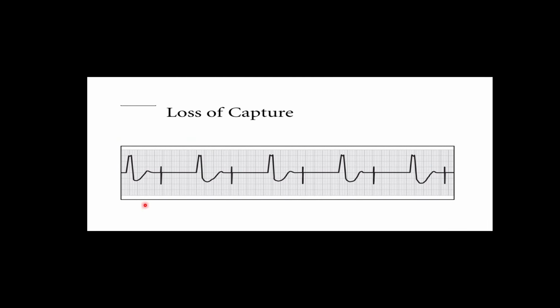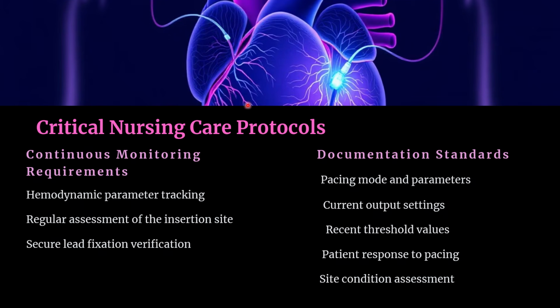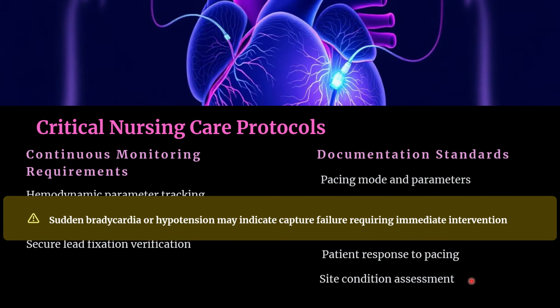Here there is a spike not followed by a QRS complex. That means there is no capture. Next is the clinical nursing care protocol. Continuous monitoring is required; hemodynamic parameter tracking is very important. Regular assessment of the insertion site and secure lead fixation and verification. Documentation standard: pacing mode and parameters, current output setting, recent threshold values, patient response to the pacing, and site condition assessment. Sudden bradycardia or hypotension can indicate capture failure, and that requires immediate intervention.